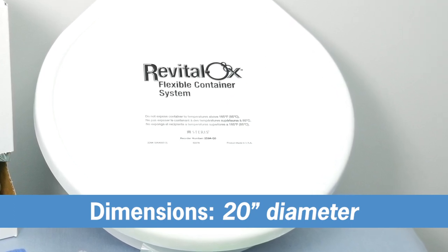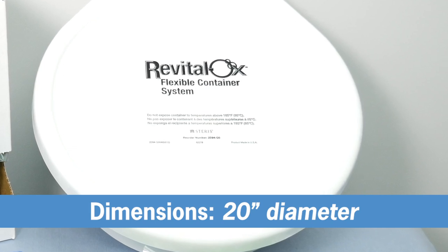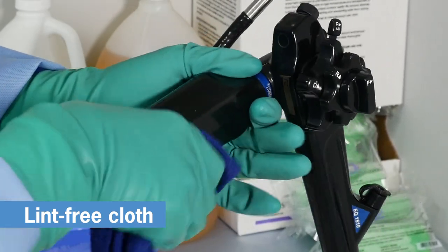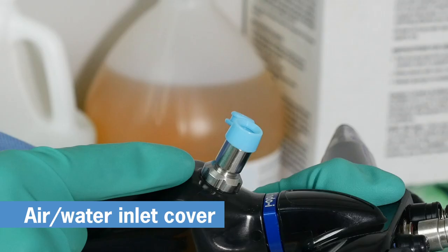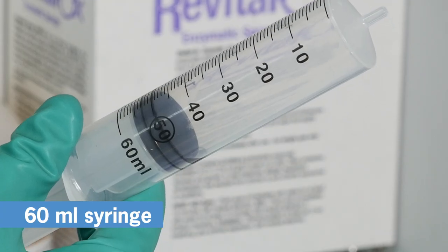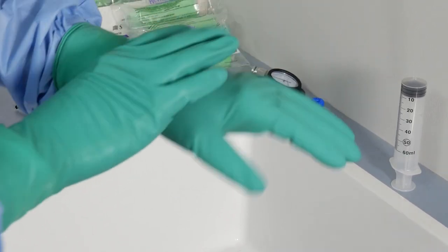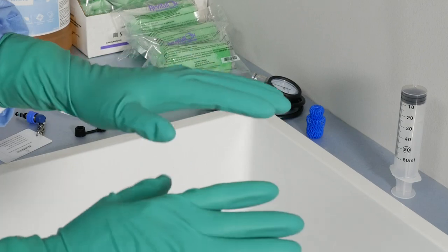The Revitalox Container System is designed to safely transport and or soak flexible endoscopes and accessories. It's a convenient way to carry your coiled Endo-i or other flexible endoscopes post-procedure. For pre-cleaning, you'll also need a clean lint-free cloth, a small basin of water, a distal tip protector, a blue air water inlet cover, the air water cleaning adapter, and the 60 milliliter syringe that came with the Endo-i. As always, have your personal protective equipment available and properly fitted to standards before you begin pre-cleaning.